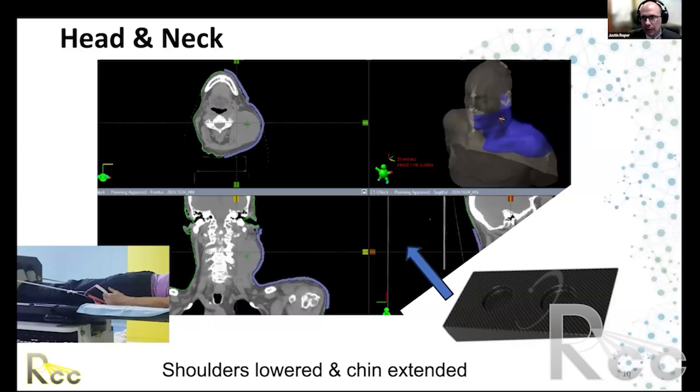Now, if you create a virtual bolus and then attempt to place that physical bolus after the fact, you've lost that luxury of building it into the mask. And if you position it on the skin, well, then we have a hardened mask going over it that may compromise the contact of the mask with the patient otherwise.